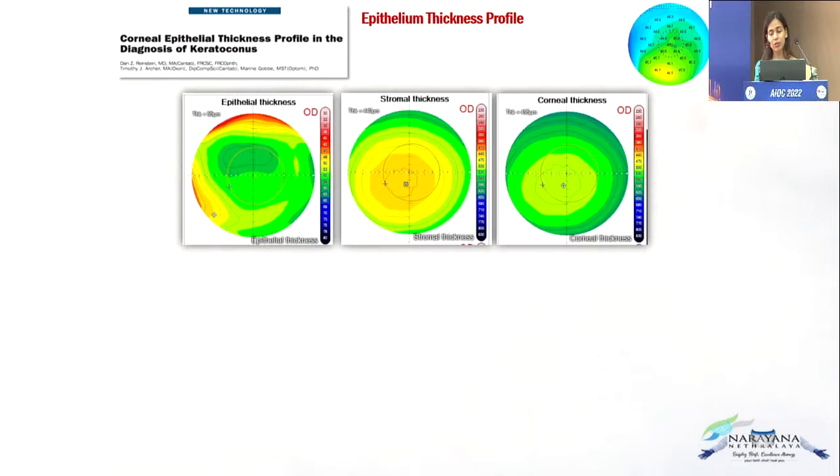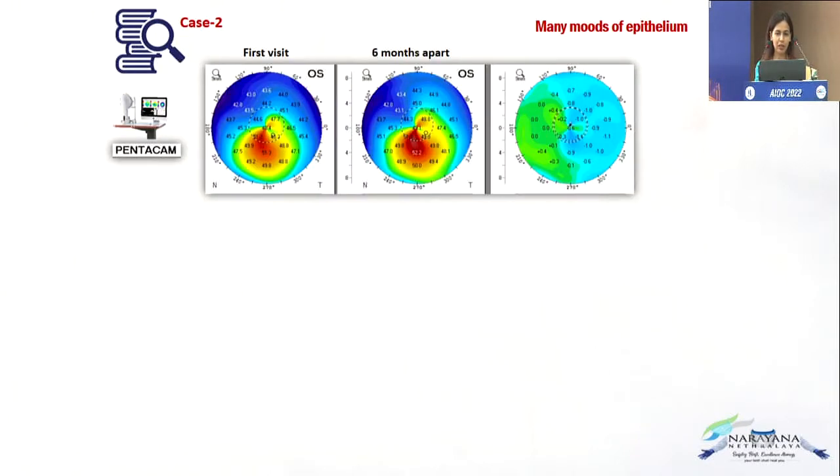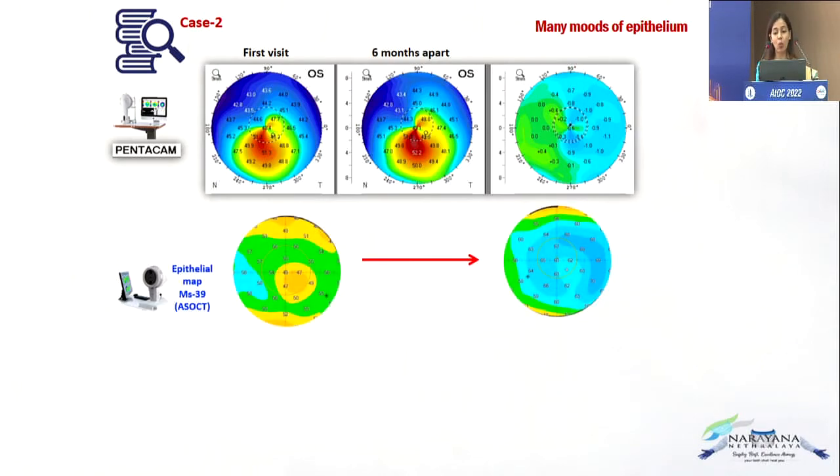Even in keratoconus, you could have similar benefits, where we're sometimes wondering, we come back with a patient who may or may not have had a cross-linking, but looks like he has a progression. And we're not sure why it's looking like there's a progression, whether the patient has had a surgery or not, and we wanted to clarify what that is.